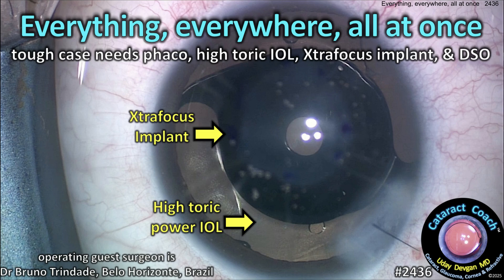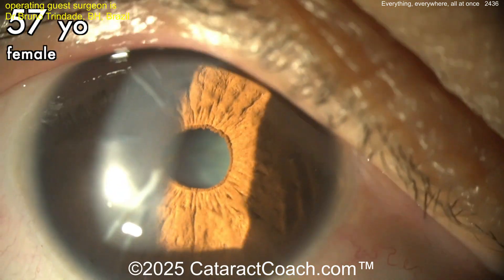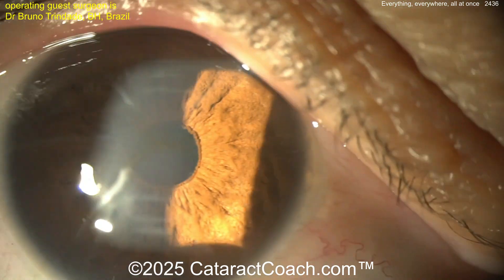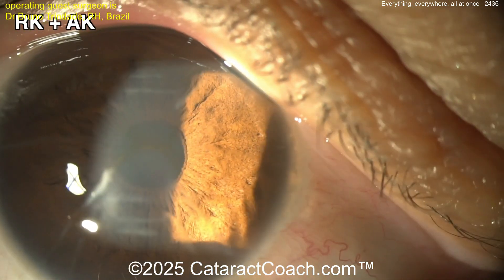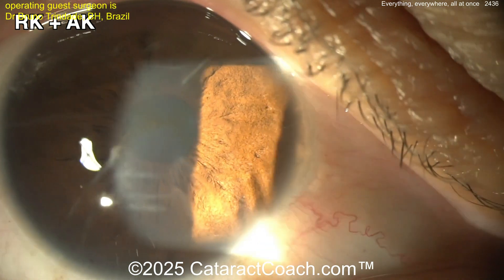CataractCoach.com: everything everywhere all at once — this tough case needs a phaco, a high-power toric lens, an extra focus pinhole implant, and DSO — Descemet stripping only. Look at the RK cuts here, but also look at 12 and 6 o'clock — look at the AK astigmatic keratotomy cuts, those big cuts that were so close to the visual axis.